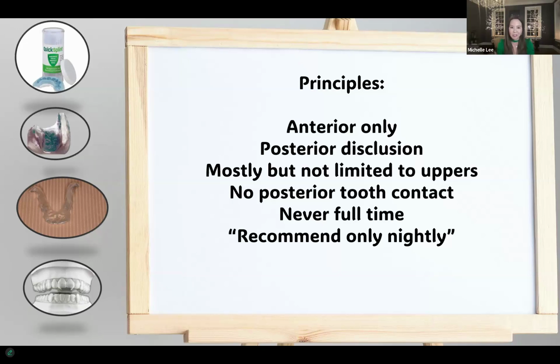It's anterior only, posterior disclusion, mostly but not limited to uppers. There cannot be any posterior tooth contact. We never wear it full time, and I recommend to my patients that they only wear it nightly.